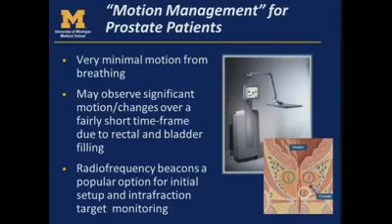You can see significant motion or changes over a pretty short time period with prostate patients due to rectal and bladder filling and changes. And so I think that's one of the reasons that RF tracking is very popular for these types of patients, because you are getting real-time information on those changes, especially as we're treating to smaller and smaller margins. This is really important if you're trying to treat with, say, a 1 or 2 millimeter margin.